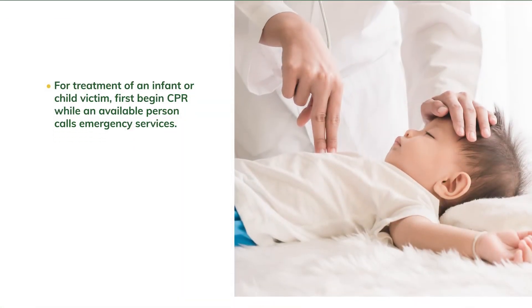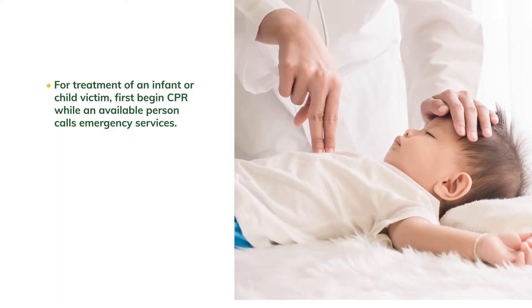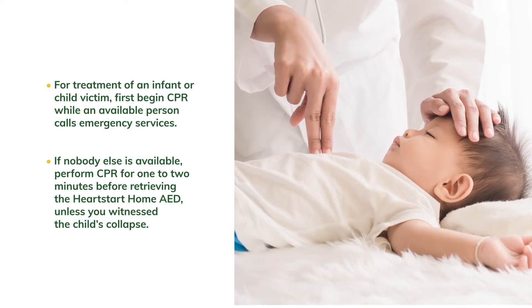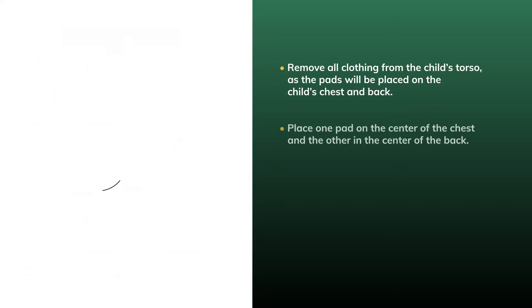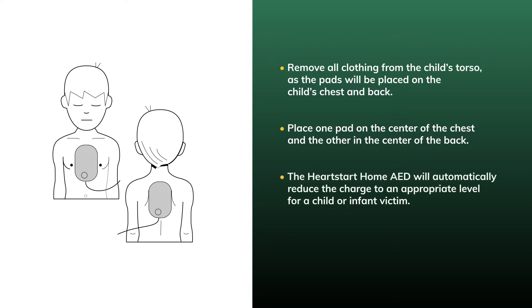For treatment of an infant or child victim, first begin CPR while an available person calls emergency services. If nobody else is available, perform CPR for one to two minutes before retrieving the HeartStart Home AED, unless you witness the child's collapse. Remove all clothing from the child's torso, as the pads will be placed on the child's chest and back — one pad on the center of the chest and the other pad on the center of the back. The HeartStart Home AED will automatically reduce the charge to an appropriate level for an infant or child victim, and infant-child CPR coaching can be provided from the device if needed.